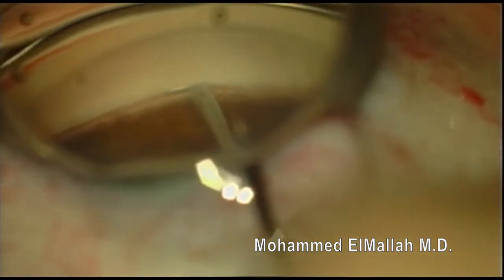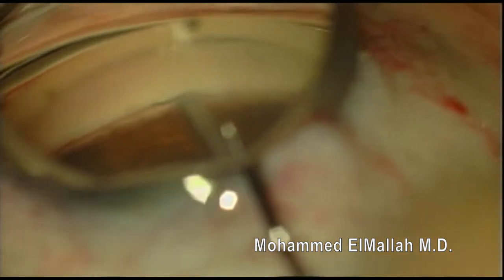This is Mohammed Almala. I've been asked to show some videos of iStent insertions that didn't go perfectly smoothly from the first attempt. Here I am inserting an iStent into the nasal angle.